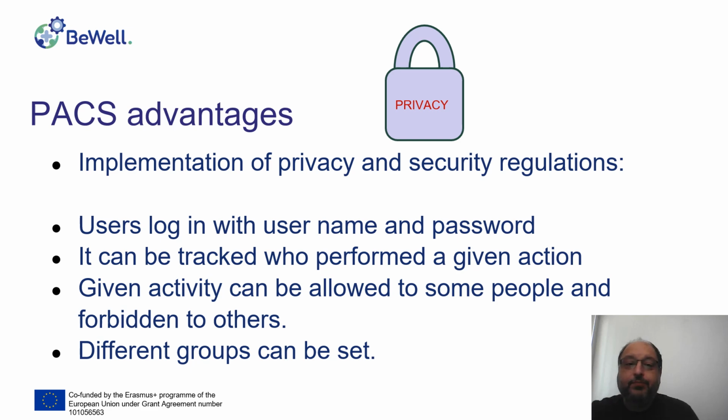For example, if some physician sent a patient, of course this referring physician will have the right to see the patient exam, but may not have the right to see the exams of the other patients who are not sent by this physician. And some group rights can be set, of course, to facilitate the work.